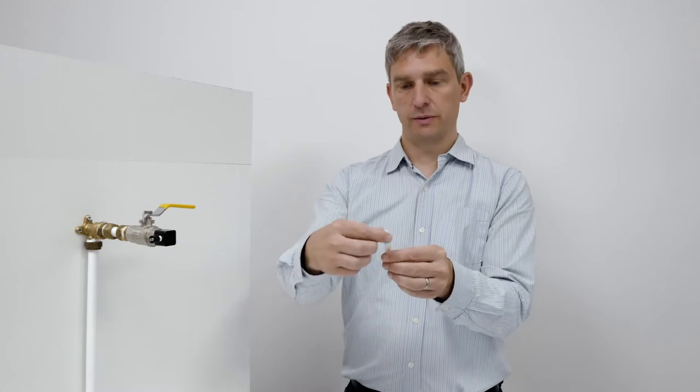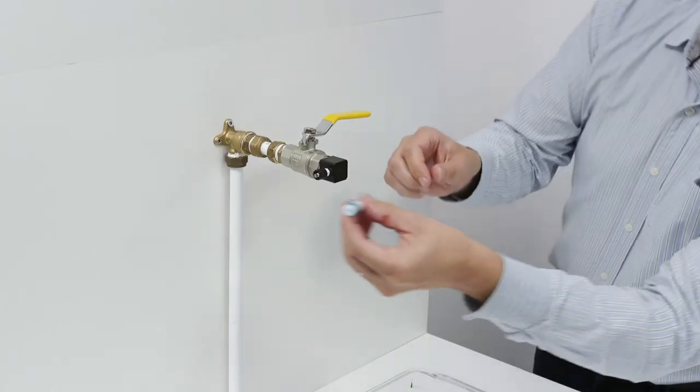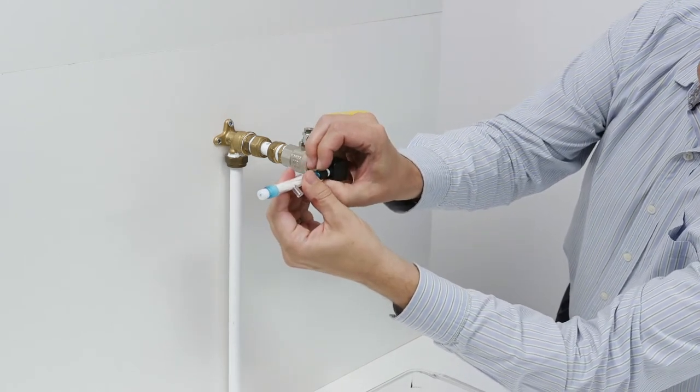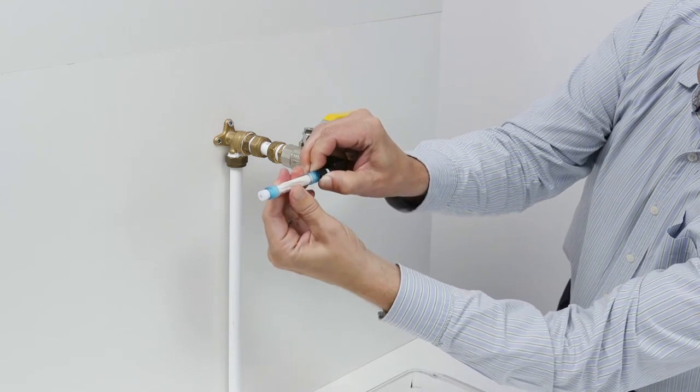Prior to doing that, we just need to check the top cap is tight, then attach the filter by pushing it in and then tightening the ring here to secure it.